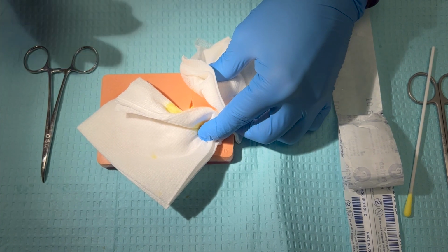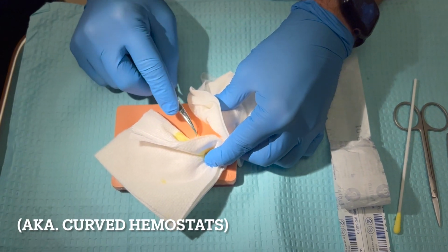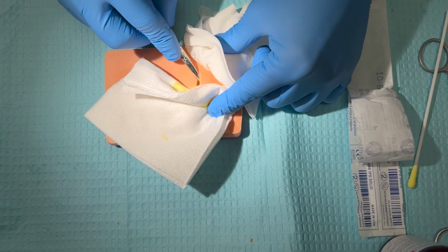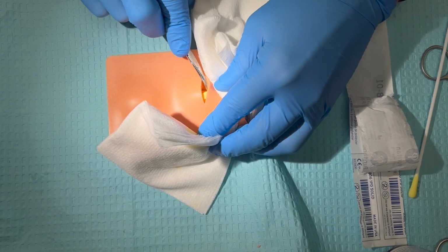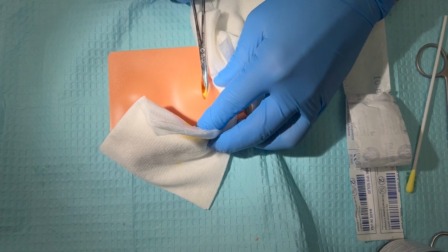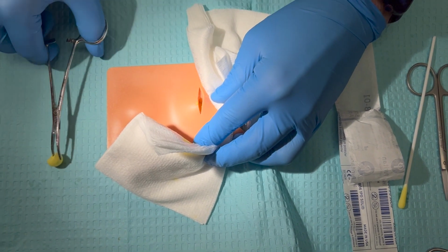Now that that's performed, I'm going to utilize my curved forceps in order to probe the area. We don't want to put our fingers in there for concern of potential sharp foreign objects that may be in relation to this. We can see in this cyst there appears to be a wall similar to a sebaceous cyst. What we can do with our curved hemostats is to try to grasp areas of that wall to break that out, and in this case we can bring it out in its entirety.